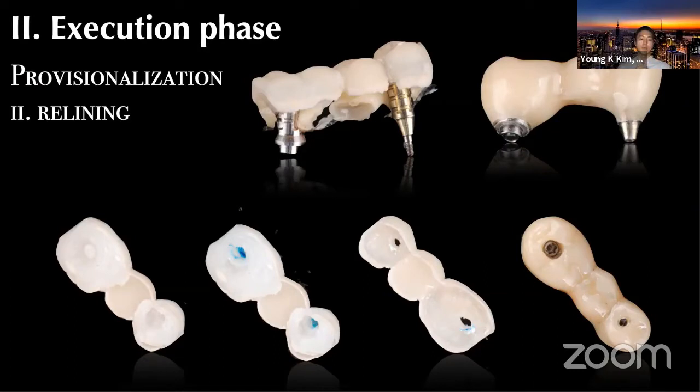The critical part is you preserve your occlusal surface interdigitation first, and then realign the patient according to the occlusion. And sometimes if you're lacking sufficient interdigitation surfaces, I purposely create more surface contact with melted compound so that when you ask the patient to bite down, you have a precise, repeatable location where you can precisely reline your temporary crown.